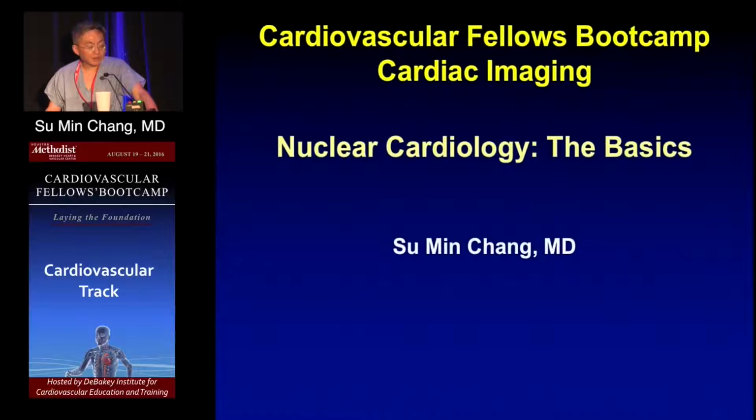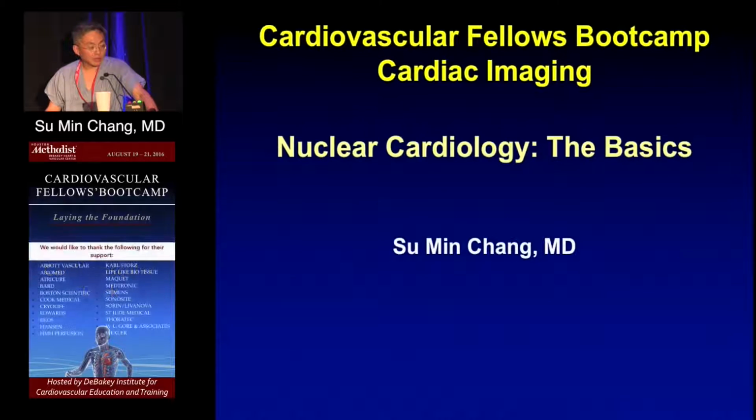And then the other indication that we currently use in nuclear cardiology is for assessment of viability. Obviously, now the MRI is probably the front line for this indication, but occasionally you have patients who cannot undergo MRI. So viability using thallium or technetium will be indicated.